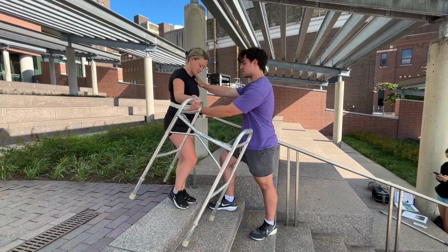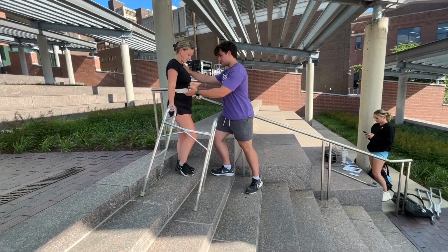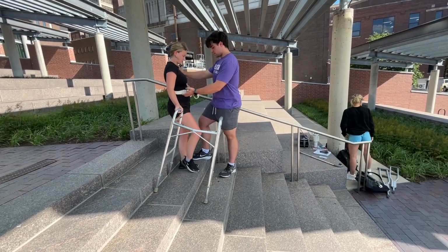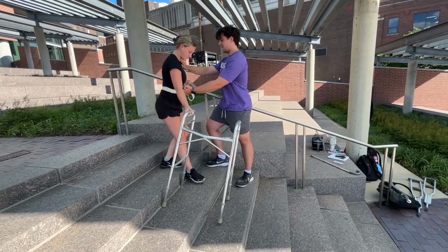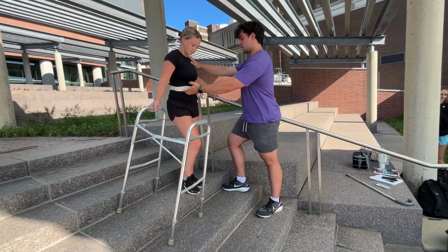Descending the stairs using a handrail and a standard walker, the patient will face the stairs and position the walker along the side farthest from the handrail, with the closed side of the walker away from the body. The front feet of the walker are placed one step below the step on which the patient stands, and the rear feet remain on the step where the patient is standing.